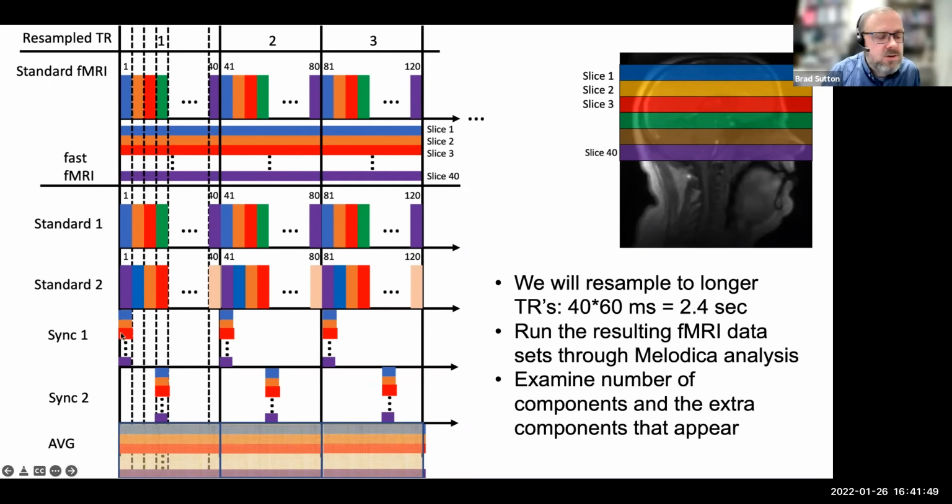Okay, then I can also do the ideal situation. The best possible thing you can do: I can sample all slices in the same volume, in the same one of these subsets, and I can wait till the next image would have come out, and I can sample all those slices in that same subvolume again. These are all sampled at the exact same time. So if there's any physiological noise, it's all sampled at the same time inside one of these volumes, okay?